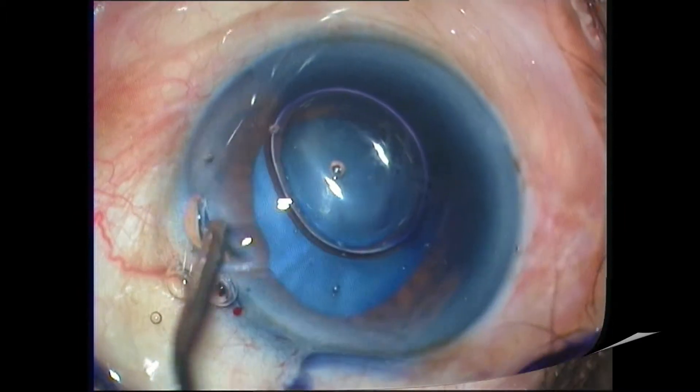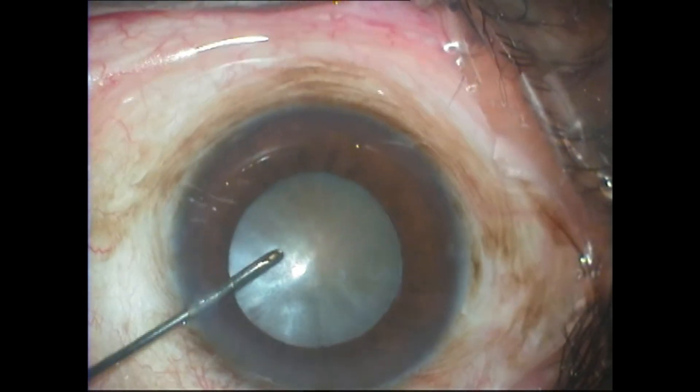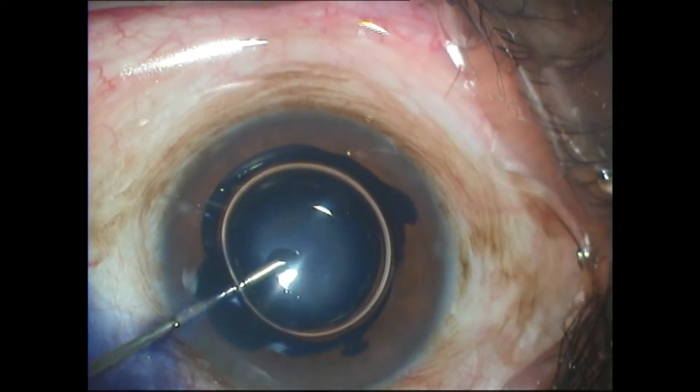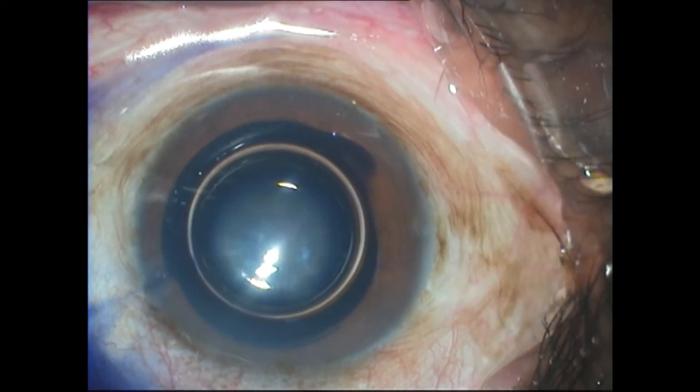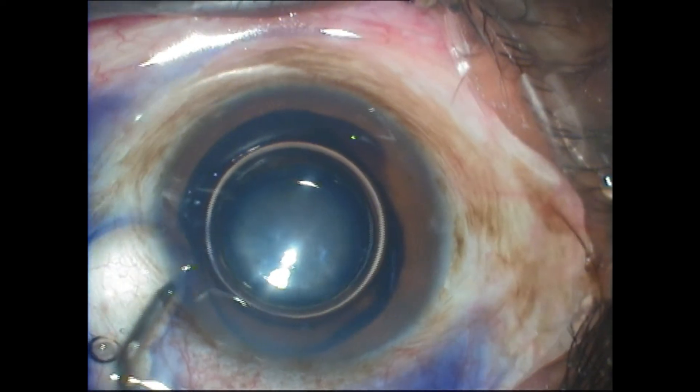This air trap technique works well only in eyes which are of normal depth or deep, and if there is no positive pressure. You can see the air trap technique again — a few drops instilled underneath the right amount of air.